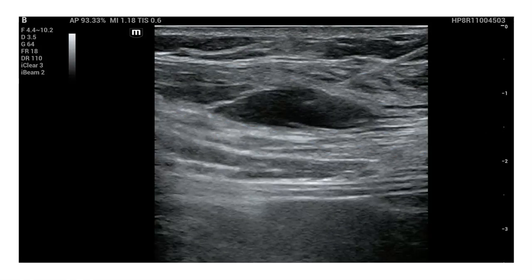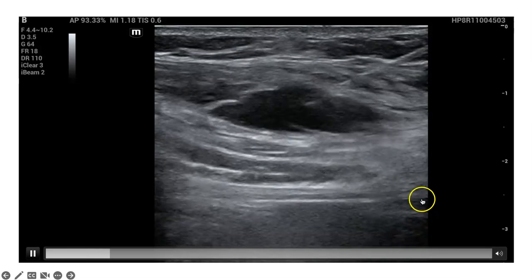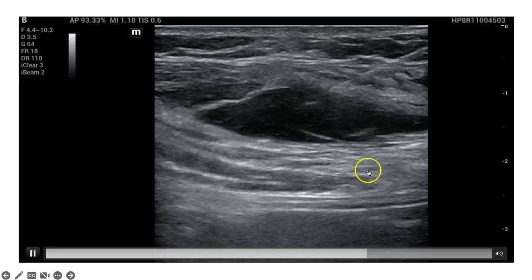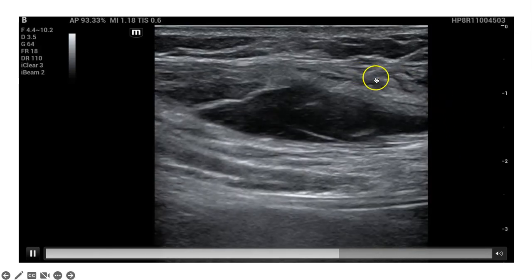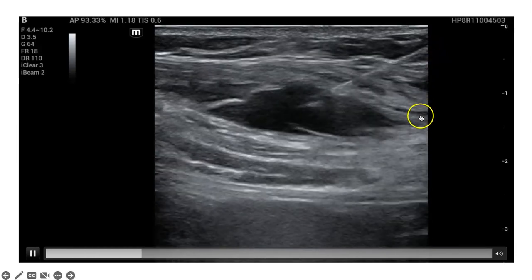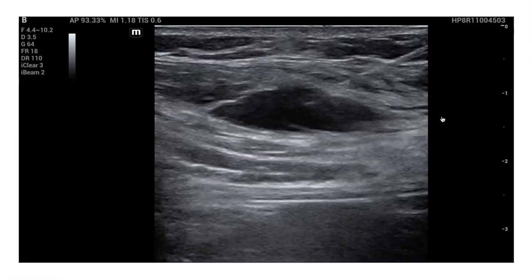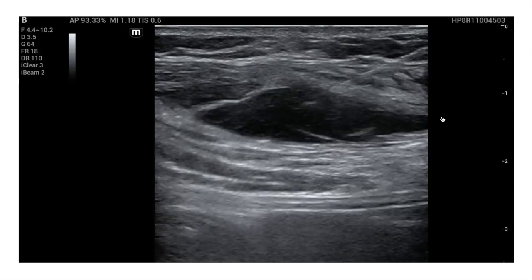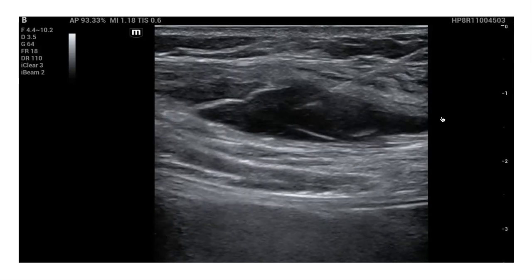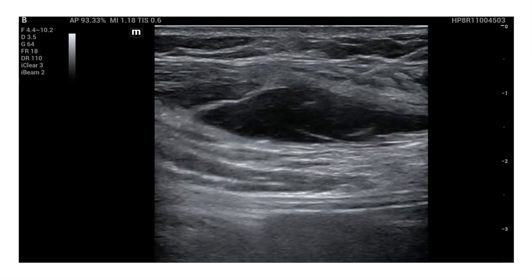Here's a video of a block that was done in our department. As the clip plays, you can see the pleura moving just down here. Superficial to the pleura we have the serratus anterior muscle, and superficial to that we have the latissimus dorsi muscle. You can see the needle coming in from the right side of the screen, and the anechoic area that you see expanding is the medication being injected. You can tell the needle is in the correct plane because we can see the latissimus dorsi muscle lifting off of the serratus muscle in its entirety, as if the two muscles are being unzipped. Seeing the latissimus dorsi lift off like that tells us we're in the correct fascial plane.